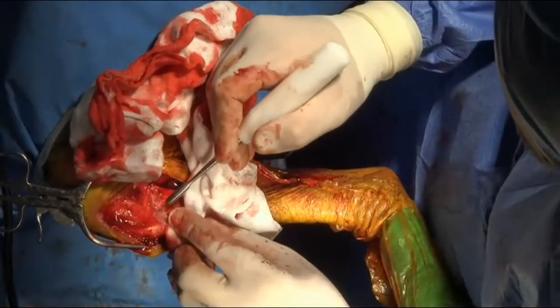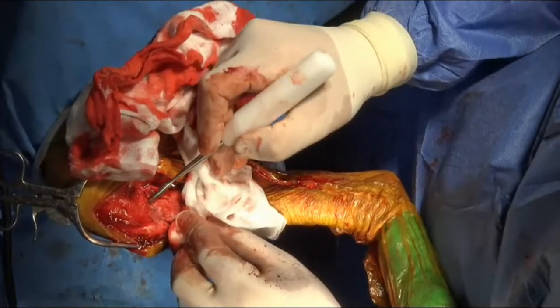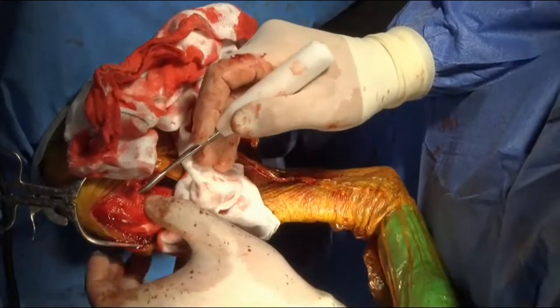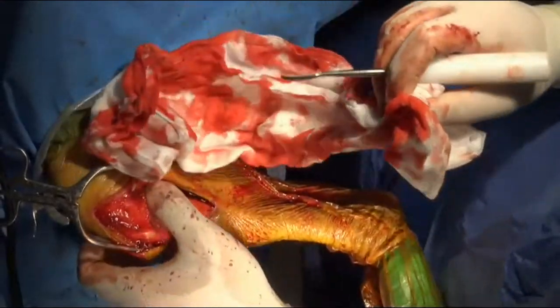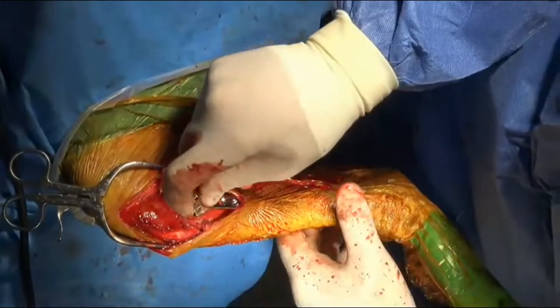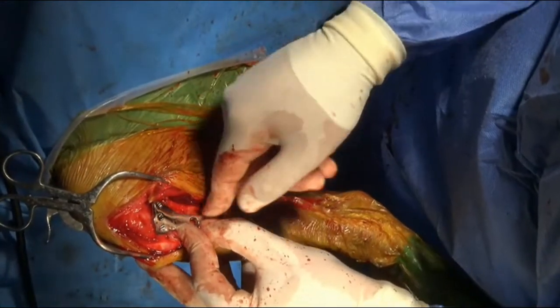And I don't know how well you can make this out, but that osteotomy is compressed really nicely all the way along. So I'm really, really pleased with that. And then the final part of what we're going to do here is actually the relatively boring part. So now we're just going to put a plate on it. And it's going to sit in here like this.